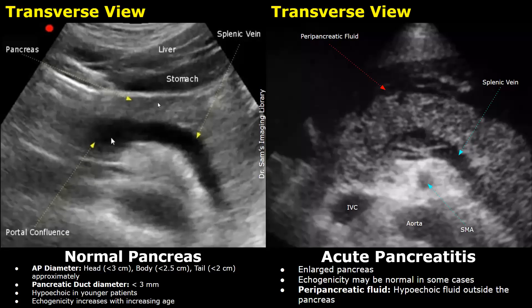In normal cases, the pancreas has a homogeneous echo texture. It is more hypoechoic in younger patients, and in older patients it becomes hyperechoic — the echogenicity increases with increasing age. Behind the pancreas is the splenic vein.